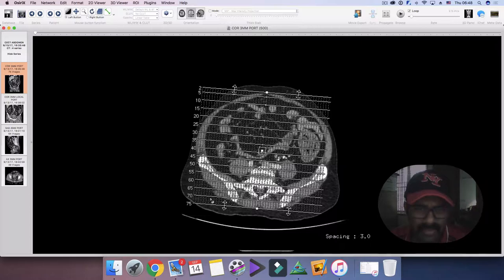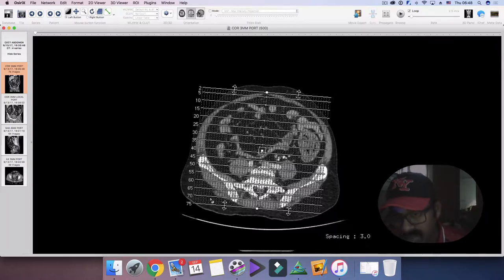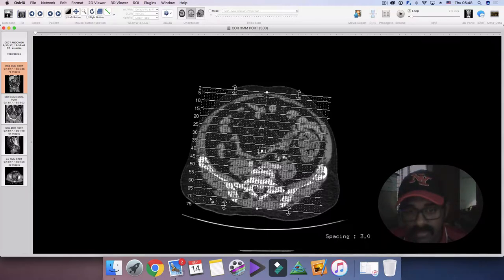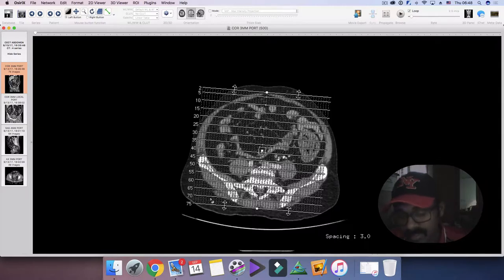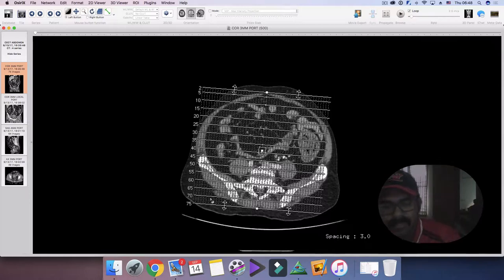He was sent in for a CT abdomen with contrast. Since intestinal obstruction was suspected, we opted not to do any oral contrast and performed an IV iodinated contrast study. Let's go through the images and see what's exactly going on in this patient.